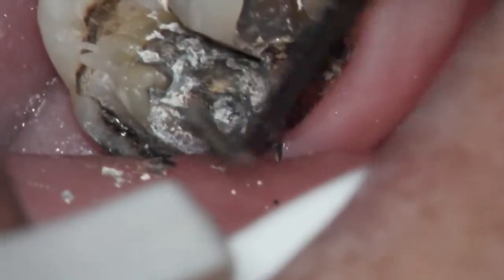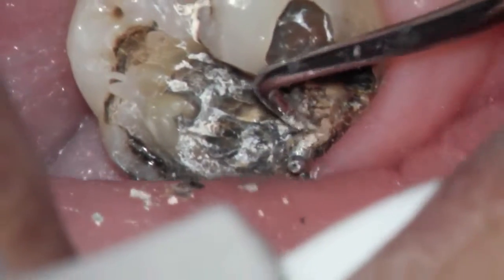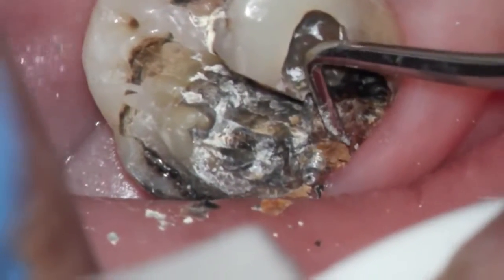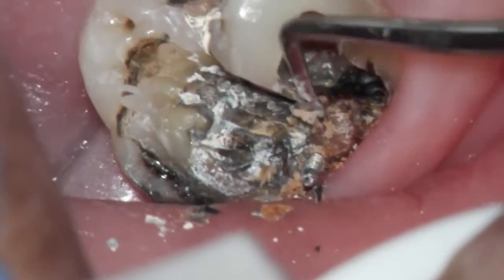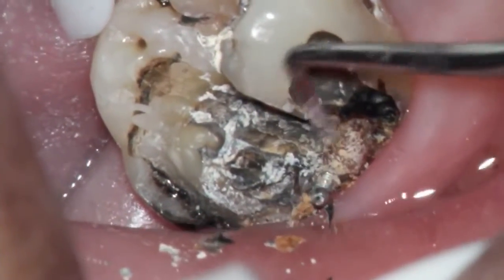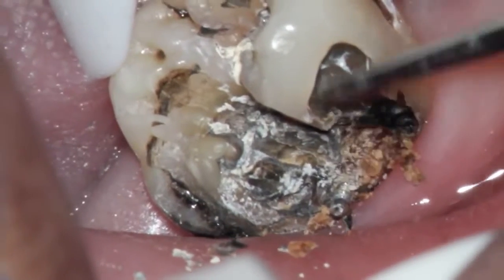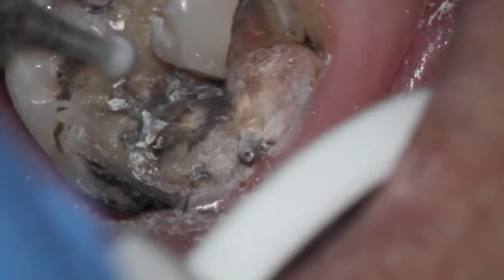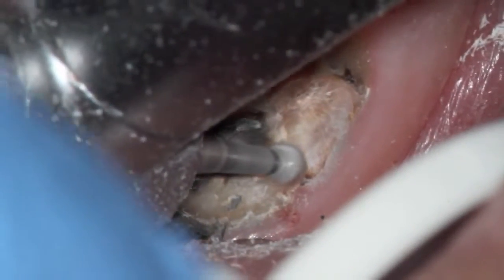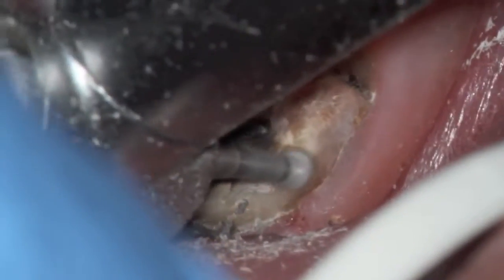The white material there was a base that was placed, and underneath the base there was a little bit of decay that has developed. I've gone ahead and determined that there's quite a little bit of decay, so we will end up using a dental drill to clean that out, and that will help us also to remove the pin that's sticking in that area. Here's the round burr that was used, and you can see how the pin came out quite easily, being very careful to try not to cause any bleeding.